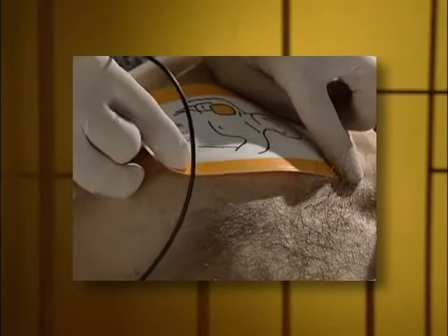Now, if there's a lot of hair on the patient's chest, you can use a razor to quickly shave their chest where the pad will go. Some versions of the LifePak AED come with a kit that includes a razor. If it's just a little hair, go ahead and stick the pads on over the hair. The important thing is that the whole pad makes good contact with the skin.